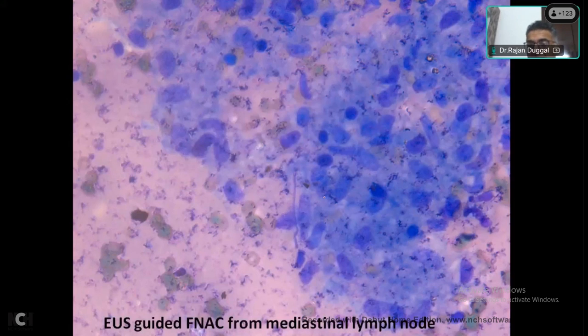So actually this patient was a case of sarcoidosis. ACE levels were high, and tuberculosis PCR culture, TB PCR, was negative. So it was a case of sarcoidosis. And in sarcoidosis, many times in biopsies we see granulomatous tubular interstitial nephritis. Commonly whenever we see granulomatous tubular interstitial nephritis, the common causes are drugs, and the second possibility is sarcoidosis, which you have to keep in mind.